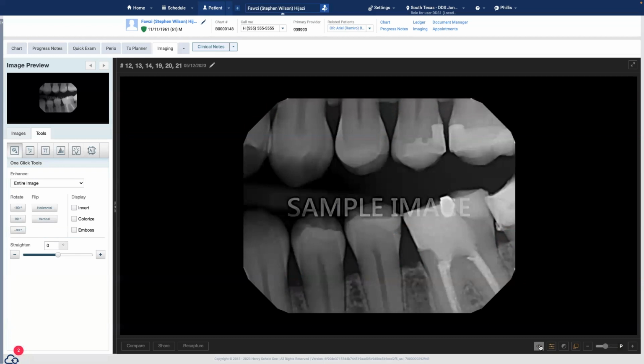I think that's really well said. The whole idea behind putting AI in this imaging software was never our intention to replace a clinical diagnosis. The main purpose for us was to add a tool that the dentist can use for patient education, as a way to help discuss certain treatments with patients, as a way to discuss, hey, we have an AI system.